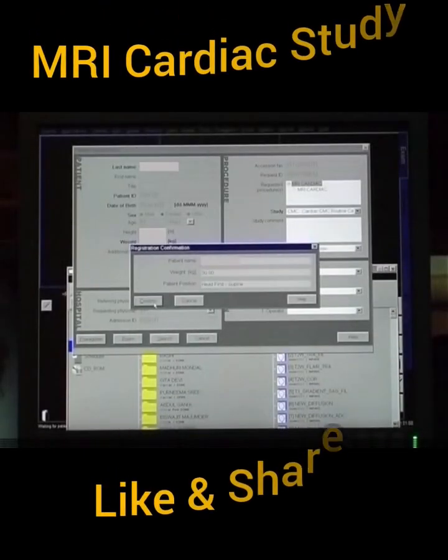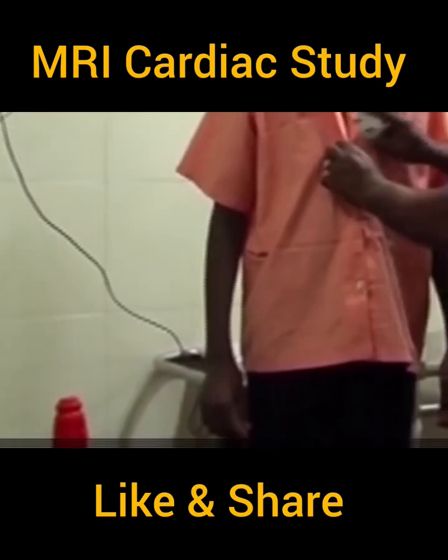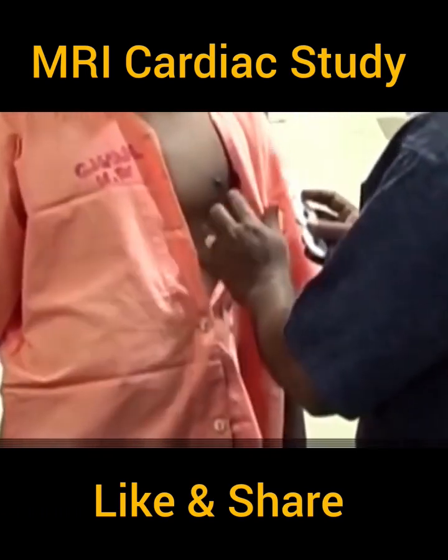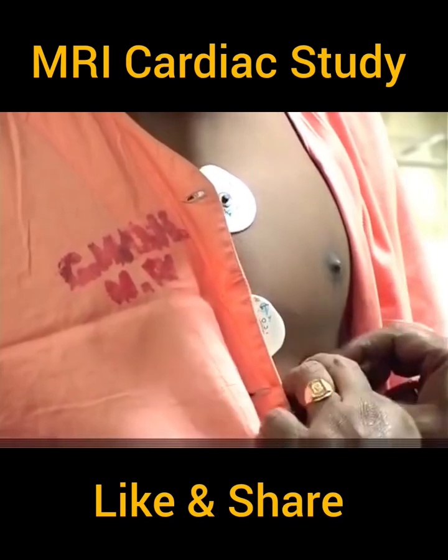This is a video presentation of a cardiac MRI study. The patient's height is 170 centimeters and weight is 55 kilos. This is important to calculate the body surface area. The patient is 19 years old and suspected to have ARVD. 3 ECG electrodes are placed on the chest after shaving.